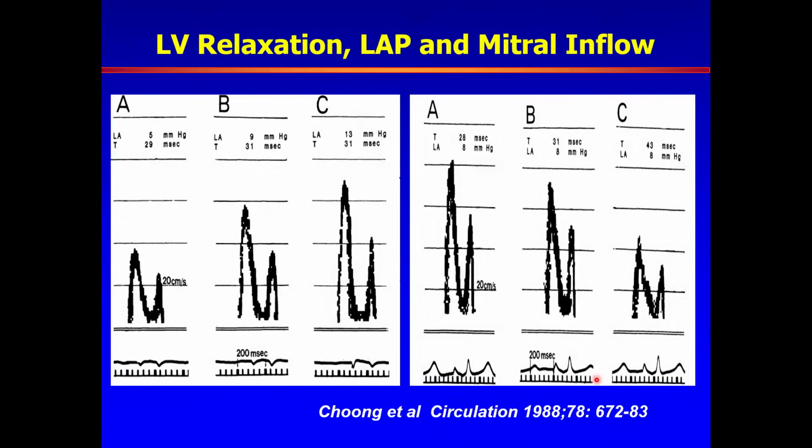The mitral inflow, which was and has stayed and remains a cornerstone when we look at diastolic function assessment, was then sort of investigated in depth. And that's an early publication from Chung and Wayman in a dog model, where as you increase the left atrial pressure, as you see here, that mitral E velocity goes up. What happens if the relaxation is made worse? And that happened with inflating a balloon that increased the pressure in the aorta. The time constant of LV relaxation gets longer, and that E velocity drops. So that shows us the two variables in the dog model that affect mitral inflow.